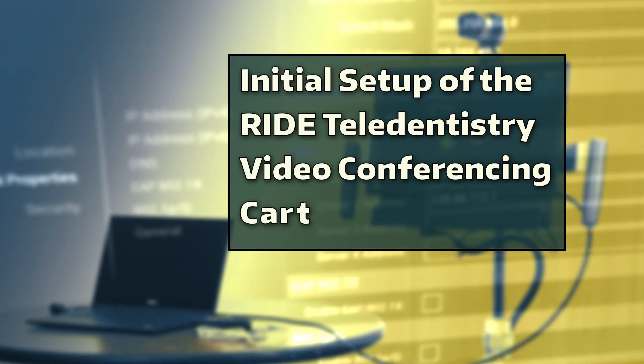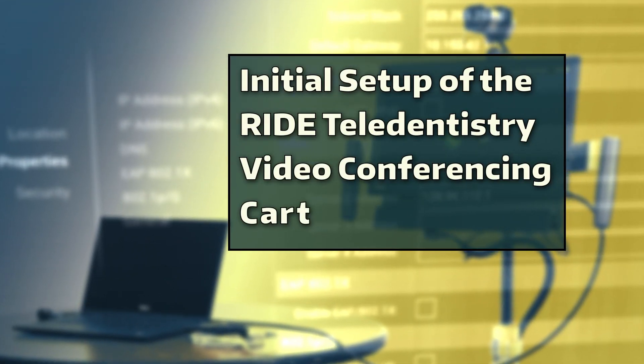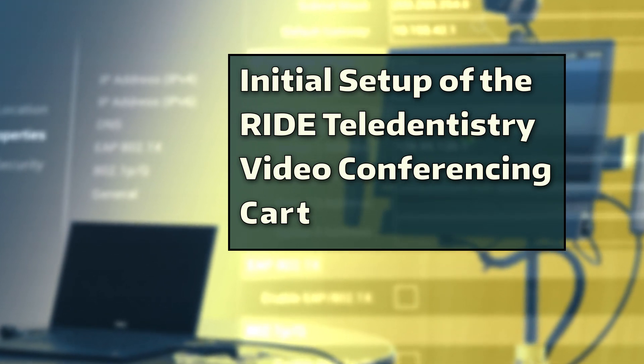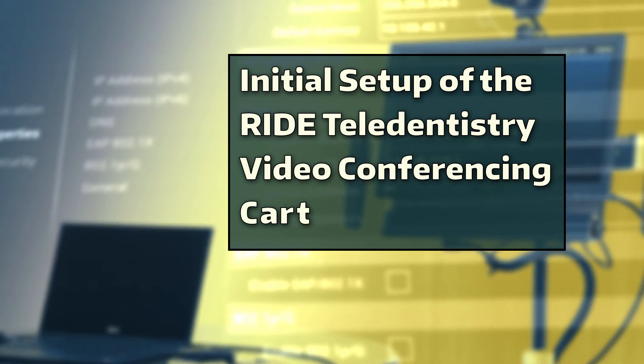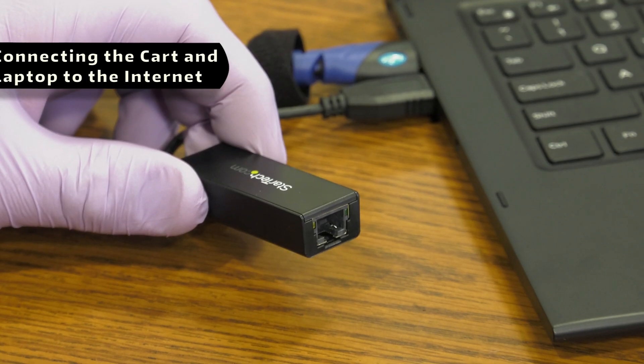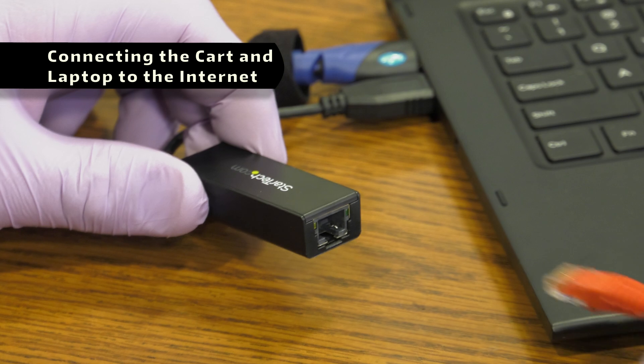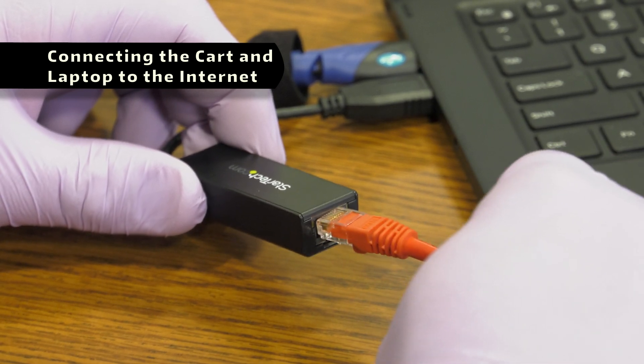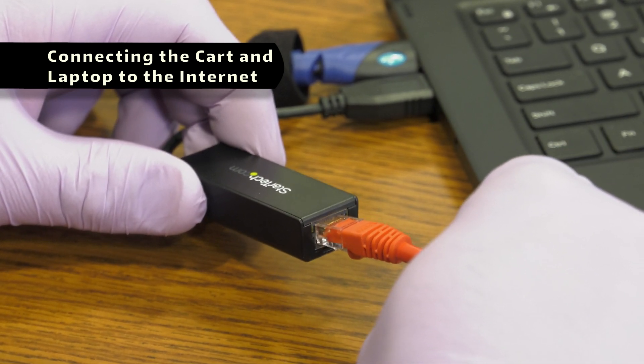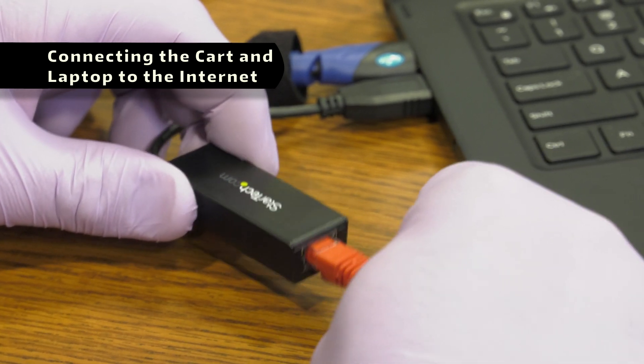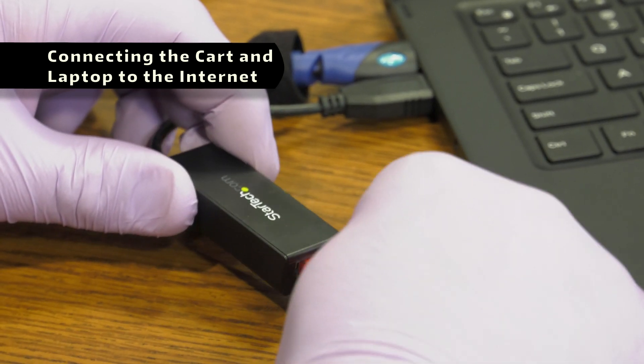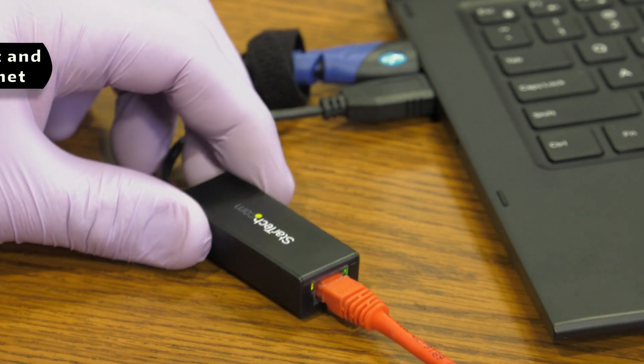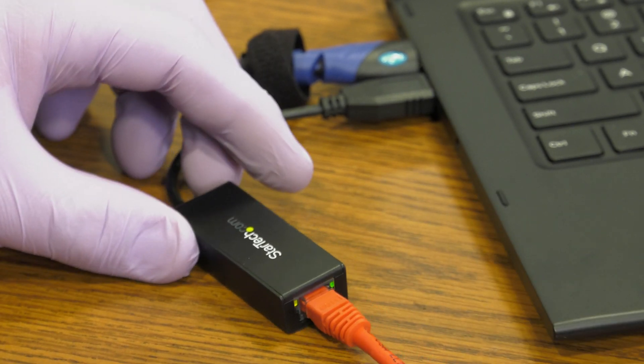Initial setup of the Ride Teledentistry Video Conferencing Cart. Before proceeding, ensure that the Polycom unit and laptop have a way to connect to the Internet. The laptop can be connected via Wi-Fi or by direct Ethernet connection.